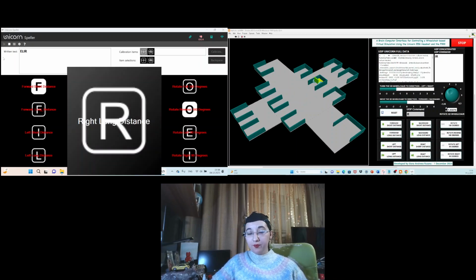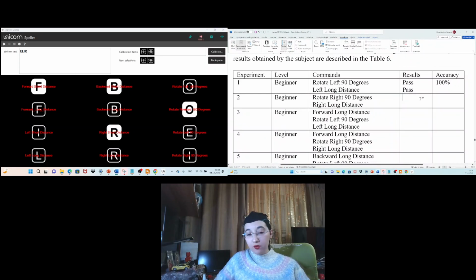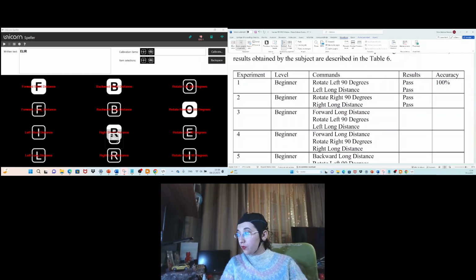Everything's perfect. Okay. So I'll add here the results. It's pass and also pass. And the accuracy is 100%. All the commands were correctly recognized and sent.